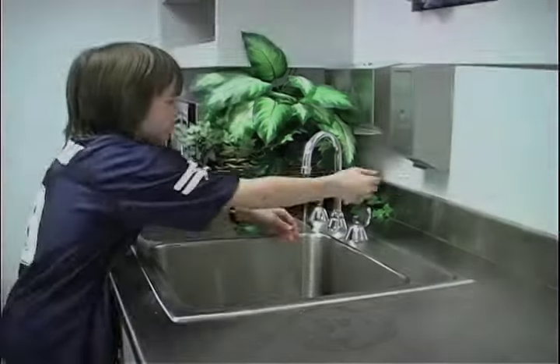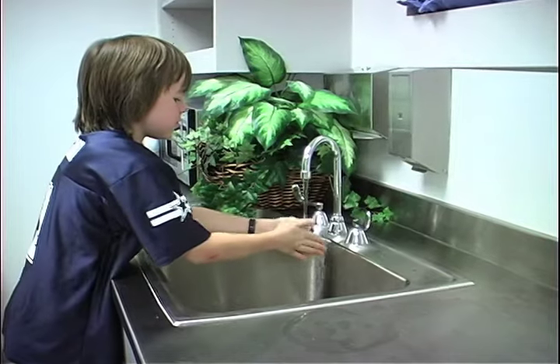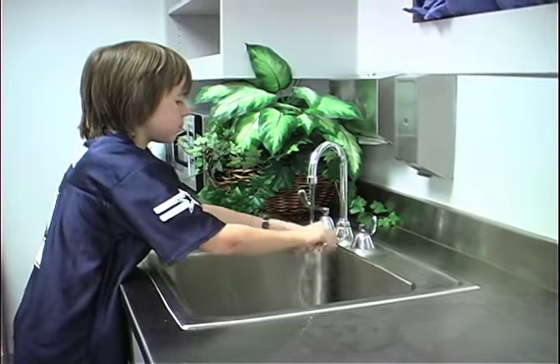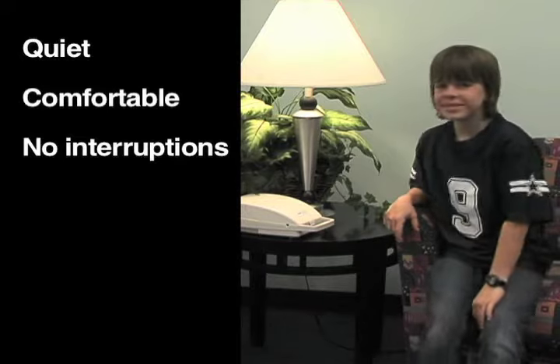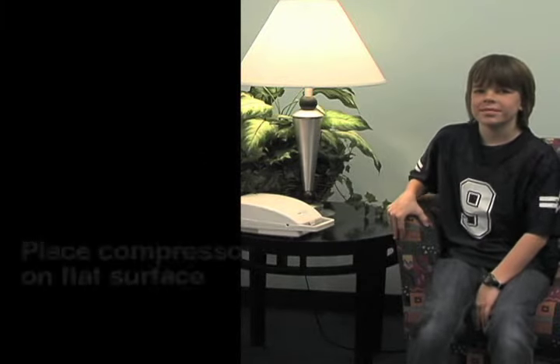There are many companies that make home nebulizers. Follow the specific instructions included with your nebulizer kit. Always wash your hands before preparing for any treatment. Hand washing is the most effective way to stop the spread of germs. Find a quiet and comfortable area in your home. It's important for your child to take the treatment without any interruptions.